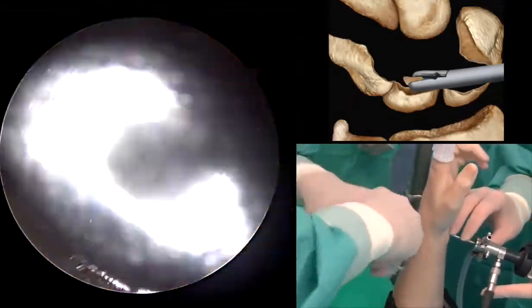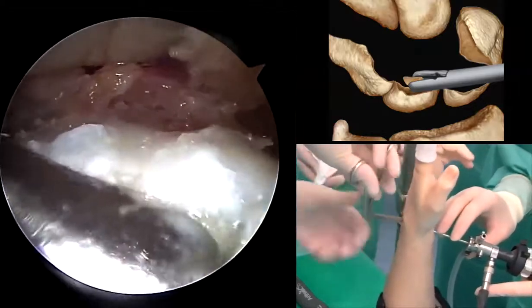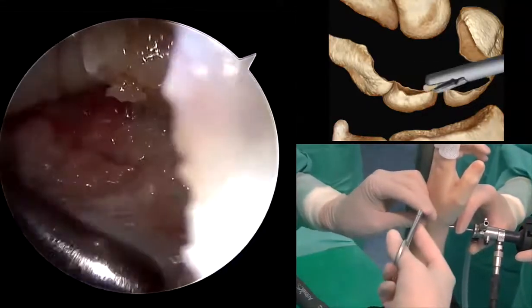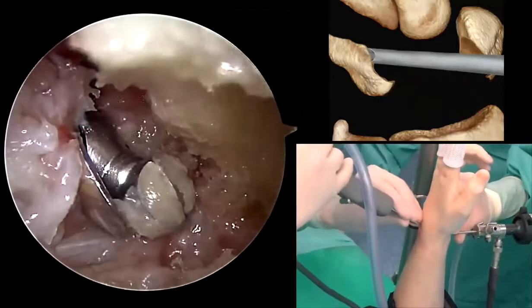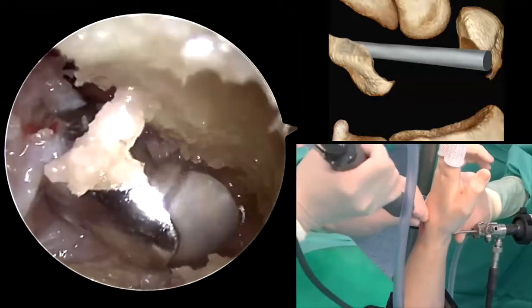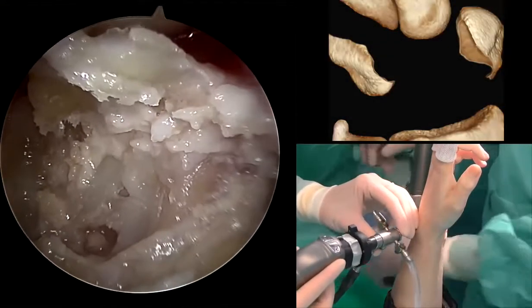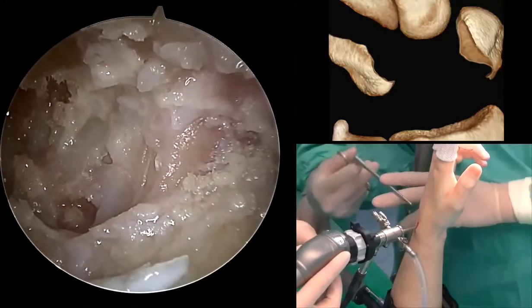Now the position of the instruments should be changed. The arthroscope is introduced through the volar central midcarpal portal and the burr from dorsal. The dorsal portions of the lunate and the triquetrum are resected, removing the bone with the burr and the peripheral portion of the bones with a pituitary rongeur.